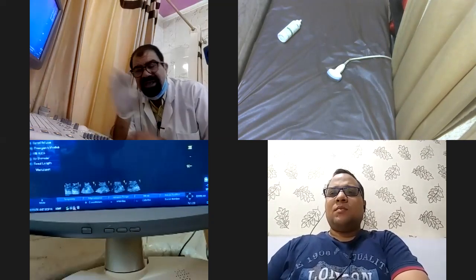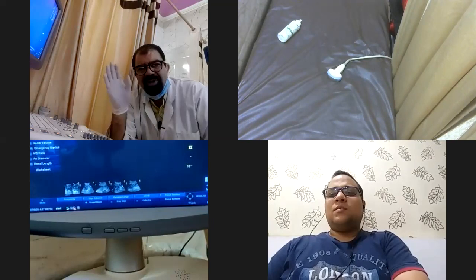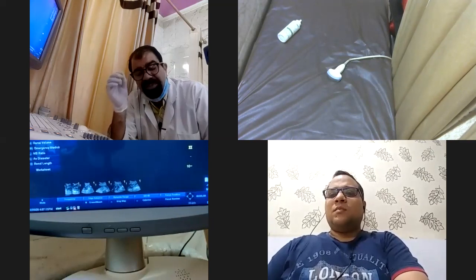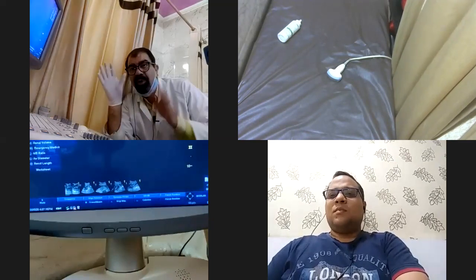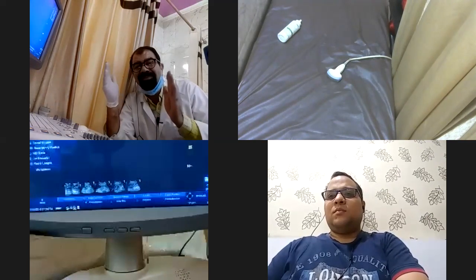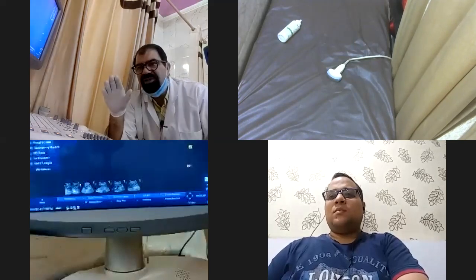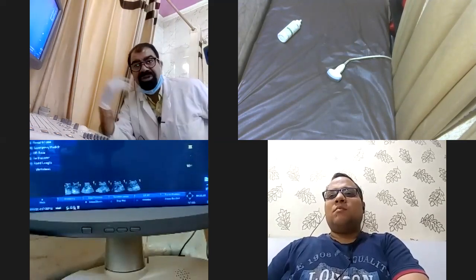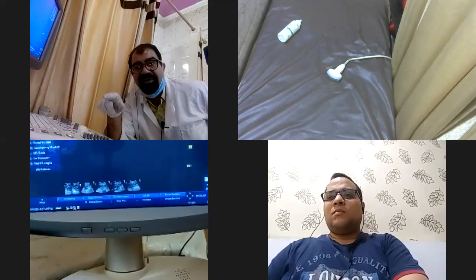So the point is that when you are seeing a slow flow somewhere in the body, for example, you are differentiating an RPOC from a blood clot, you have to adjust the PRF, pulse repetitive frequency. So the important point is that the frequency and the pulse repetitive frequency are not same. PRF has nothing to do with the frequency. Now, setting a frequency depends on the area of interest and the habitus of patient. If patient is obese, I have to decrease the frequency, and that will be at an expense of resolution.